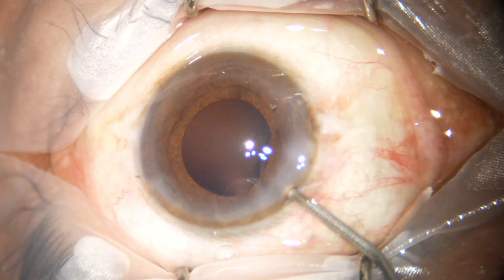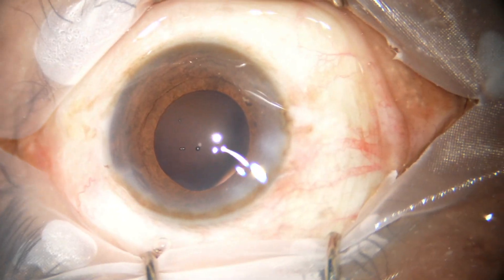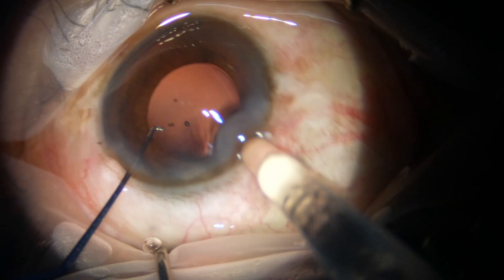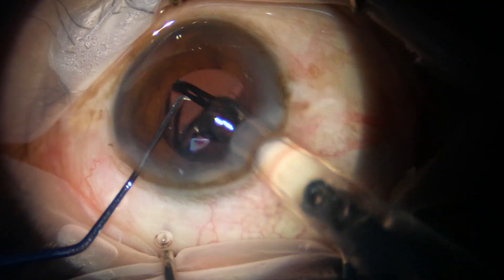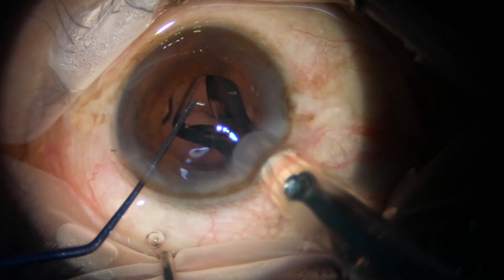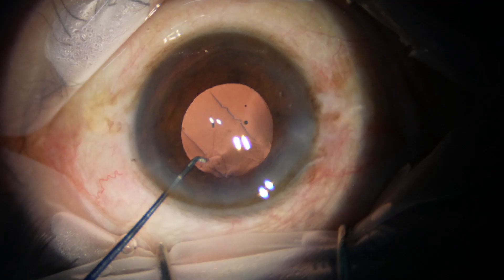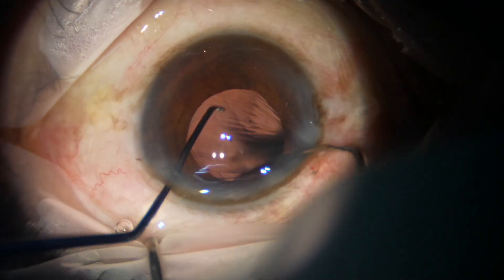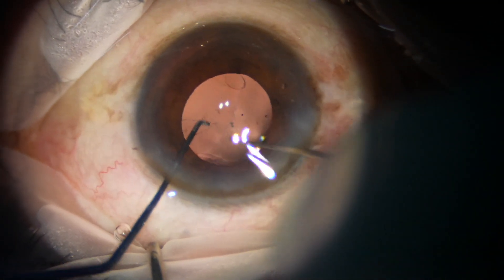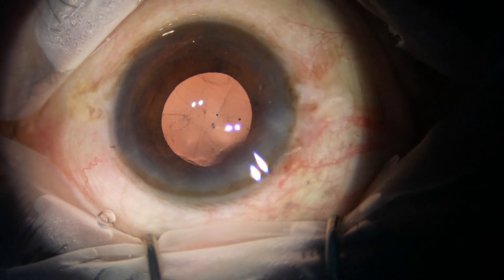Now I am using visco to implant the intraocular lens, because visco will dilate the pupil a bit. I will be able to see the pupil margin at some places and, taking guidance from that part of the rhexis, I will be able to confirm that the lens is in the capsular bag. The intraocular lens has been implanted in the capsular bag. I am checking with two hooks and confirm it is in the capsular bag.